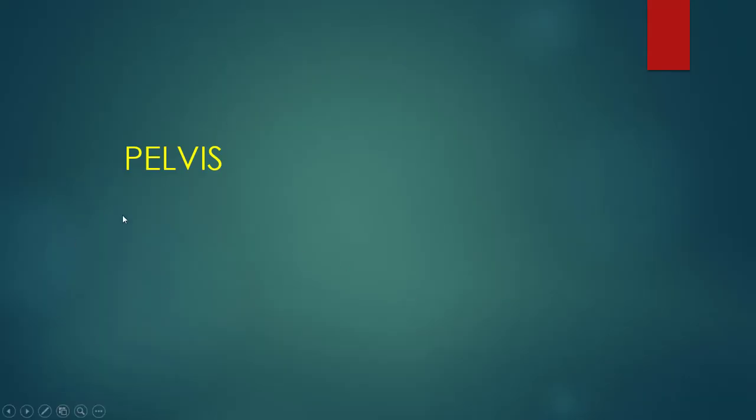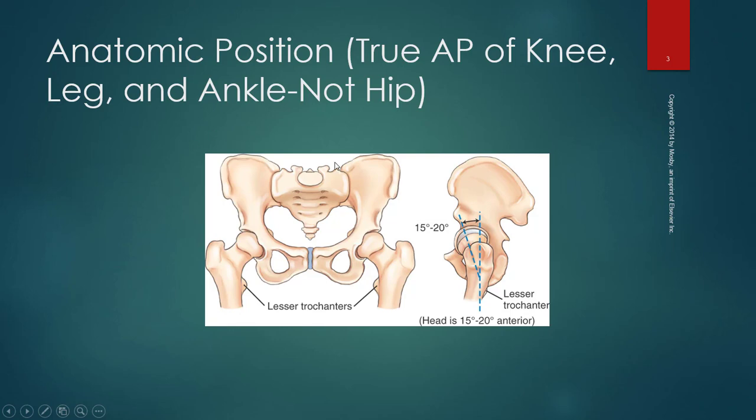Hi and welcome to positioning for the pelvis. We are going to learn a few different views of the pelvis that we can take during radiography.